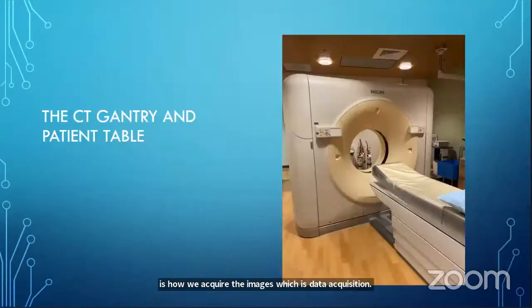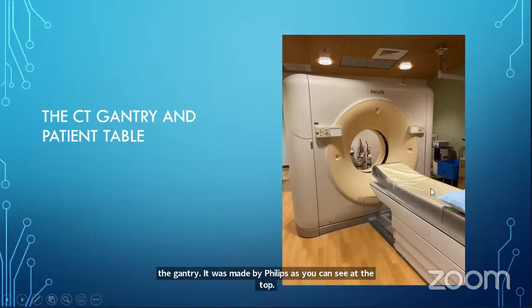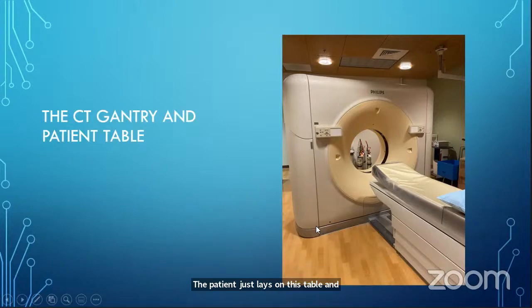So here's just a picture of the CT scanner that I work with every day. Here you'll see the table, and this is the gantry. It was made by Philips, as you can see at the top. The patient just lays on this table, and then we raise the bed up and slot them into the gantry there.